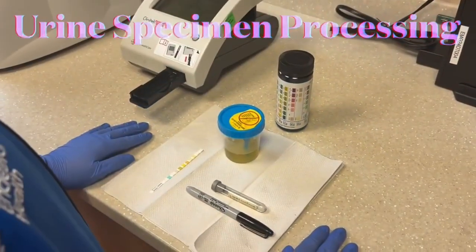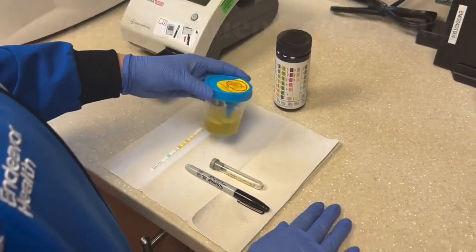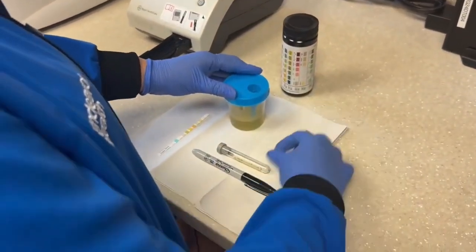Let's review the steps to process a urine specimen. First we're going to mix the sample well and visually inspect the urine, making note of the color and clarity. To avoid contaminating the urine specimen, we'll collect the urine culture first using a sterile collection device.